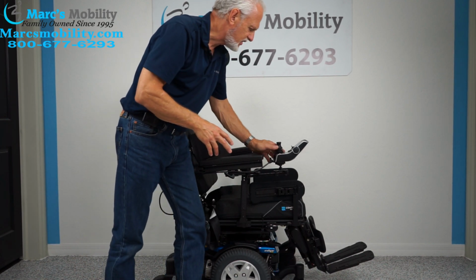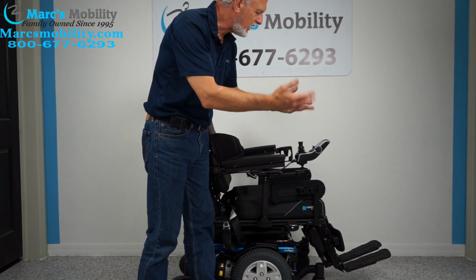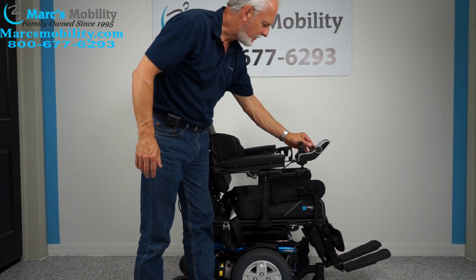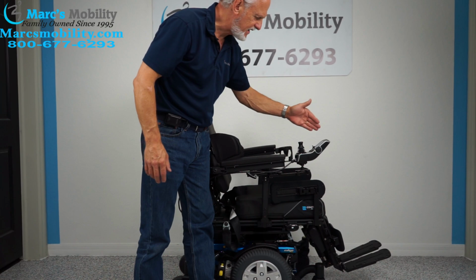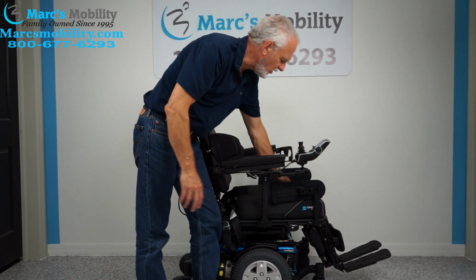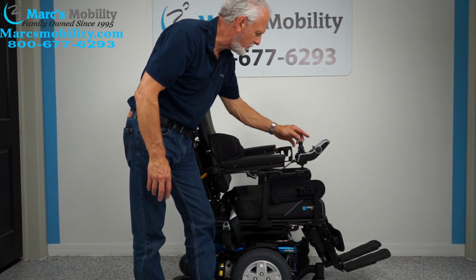But all the functions on this chair have to be worked through the joystick. So if you want the seat to raise, tilt, or recline on the legs, it has to be done through here. So you go to the button on the left and you keep pushing it forward until you see a picture of the seat. When you see a picture of the seat on the screen, whatever is yellow is what the function is going to be.